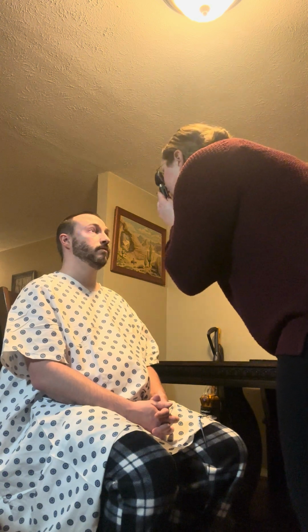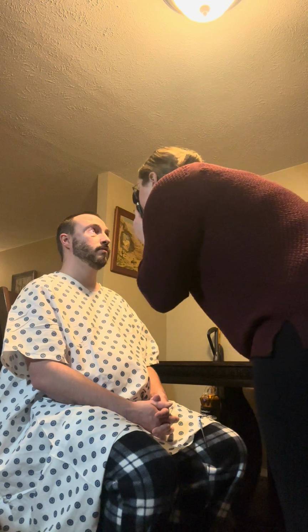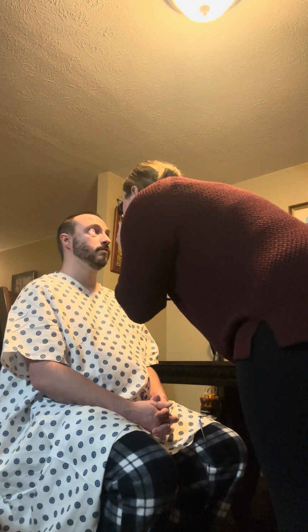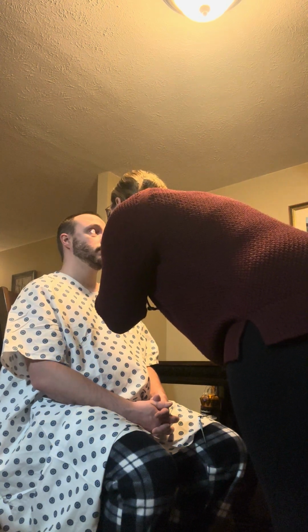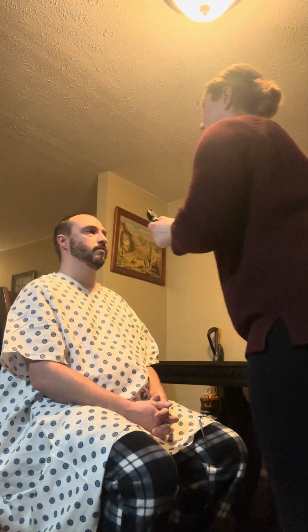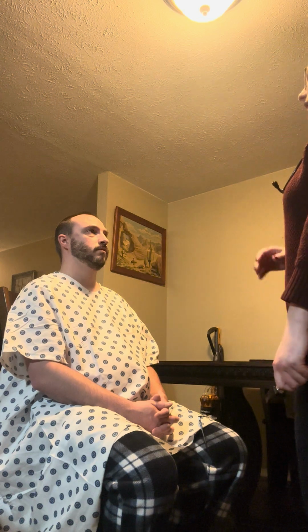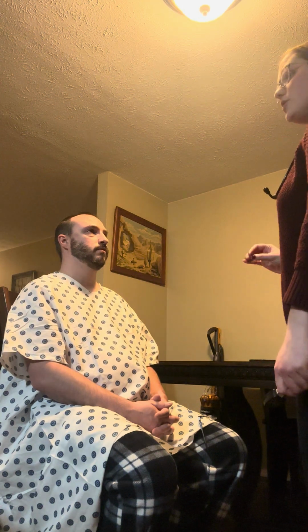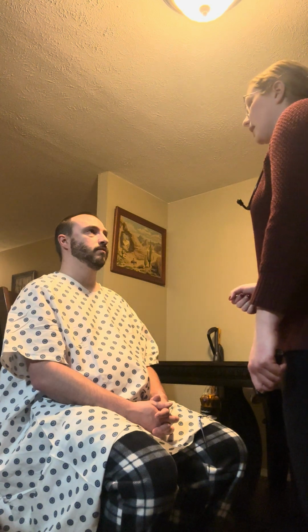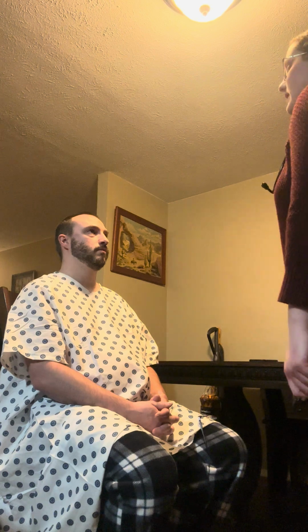eye. And I do see the red light, the red reflex. I'm going to go into that internal structure. And I am able to visualize as well all 4 quadrants of that eye. Again, no abnormalities, no nicking, hemorrhaging, or cotton wool. And I was able to see the optic fundus, the same as the other eye.